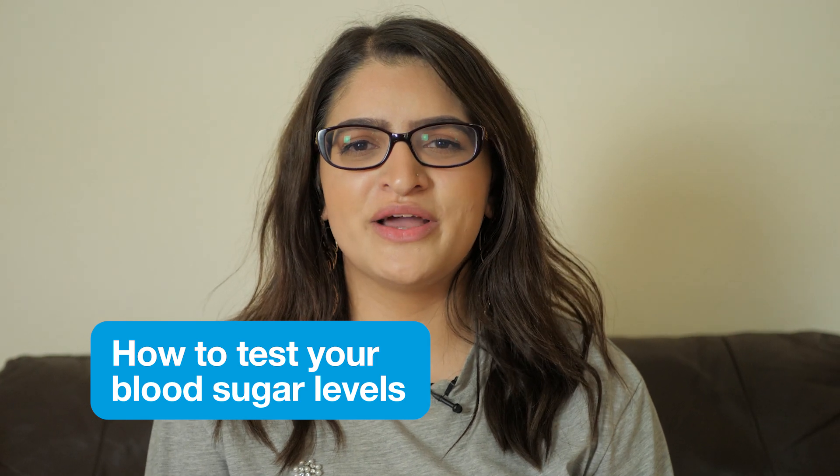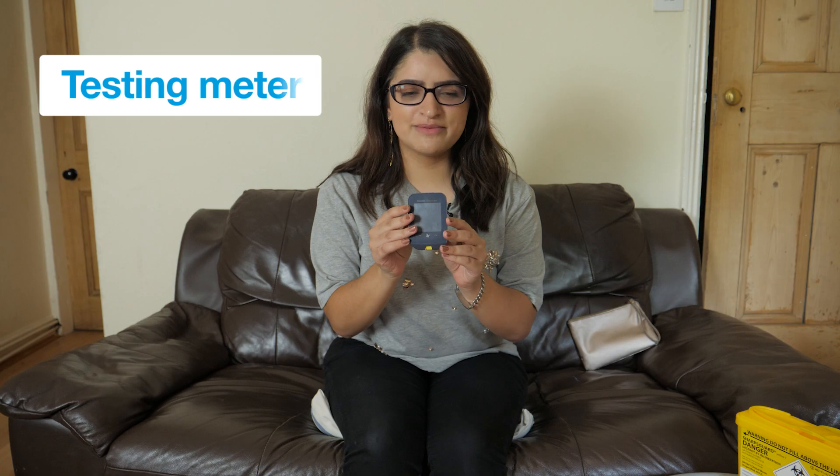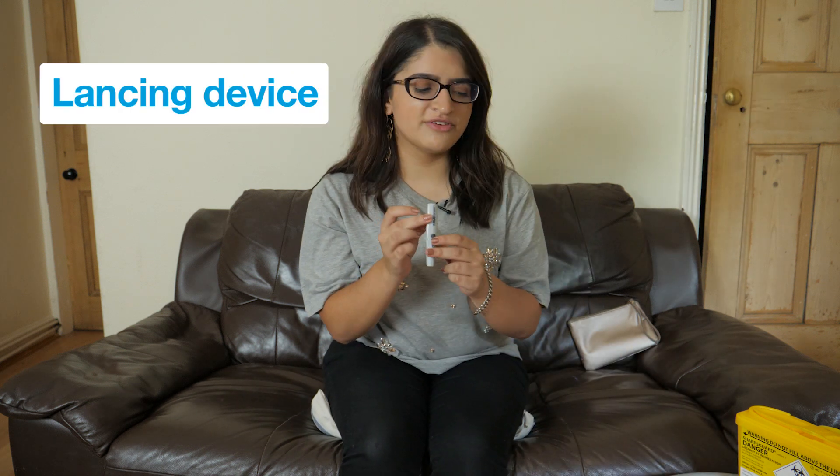Hi, I'm Kaya and today I'm going to be showing you how to safely test your blood sugar. So here's what you need: a testing meter, some test strips, a lancing device, a lancet, and finally a sharps bin.